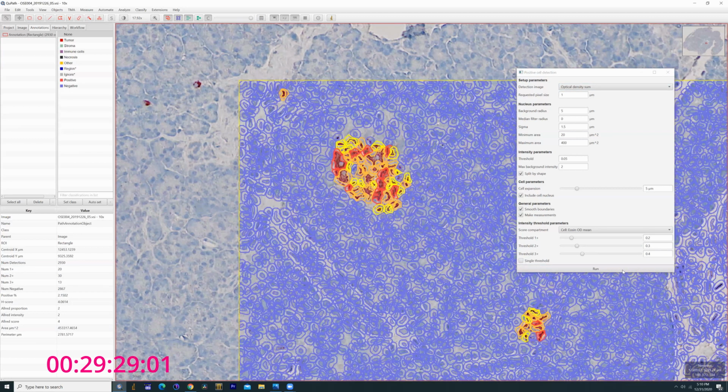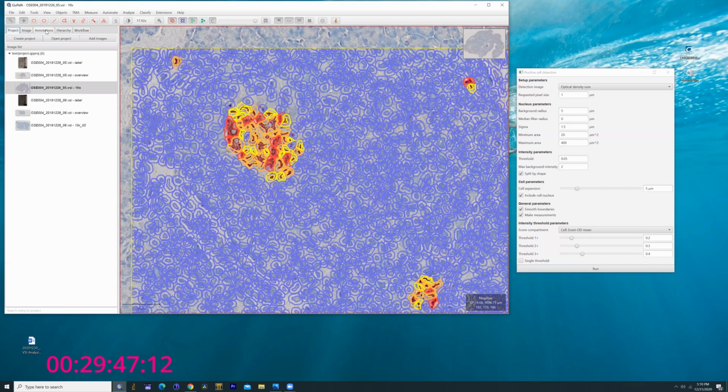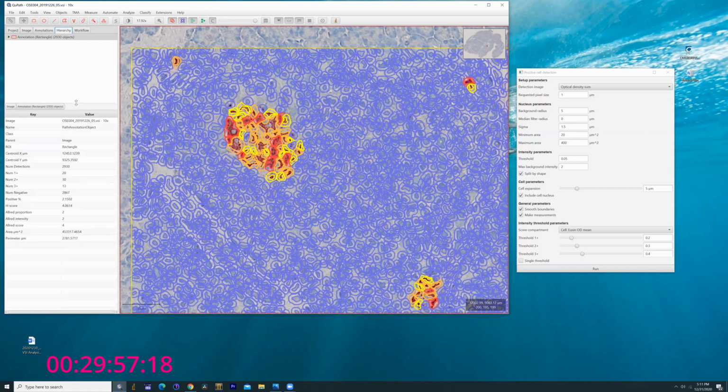From this, you can see that within the stain, there's actually regions that are a little more intensely labeled with the precipitant, and you get a little more gradation. Okay, so we have the project, we have the image data we saw before for the separation, and now we have the annotation and hierarchy. Annotation and hierarchy basically are these sections for drawing off and labeling and numbering.